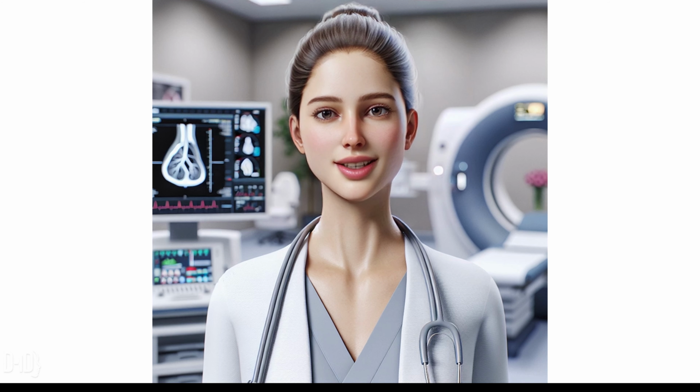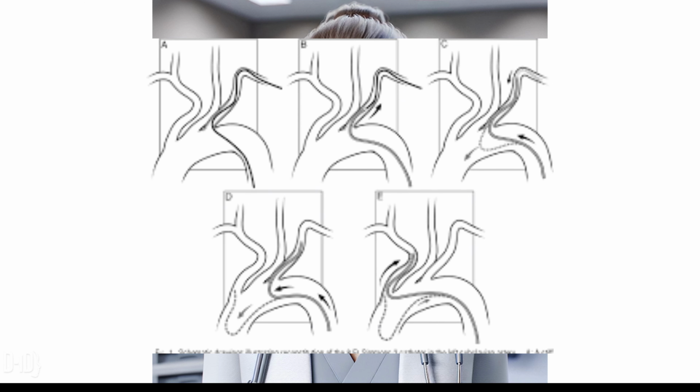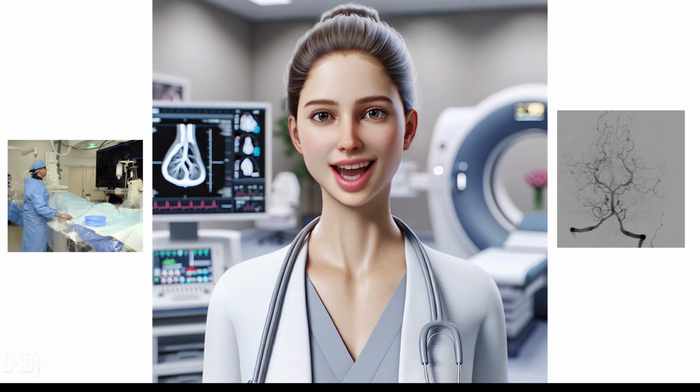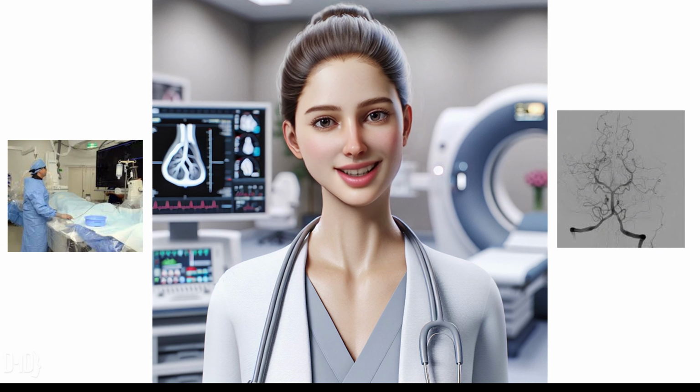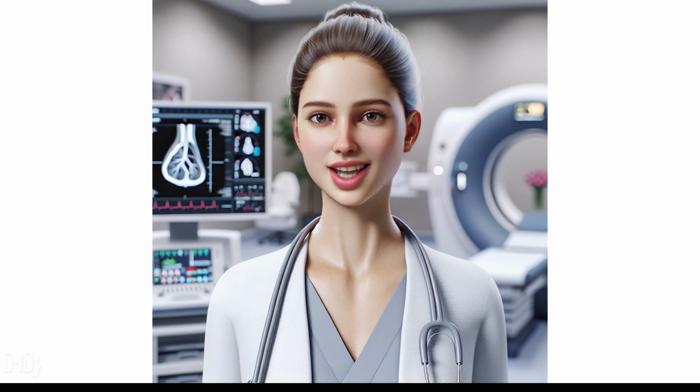Advancement to the cerebral vessels. The catheter is carefully advanced through the blood vessels, navigating toward the carotid or vertebral arteries, depending on the area to be studied. Fluoroscopy, real-time X-ray imaging, is used to guide the catheter precisely into position near the blood vessels supplying the brain.